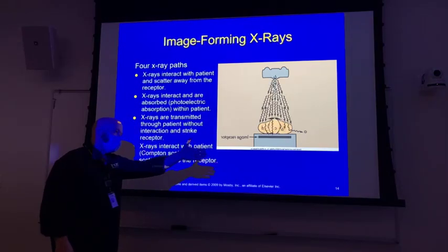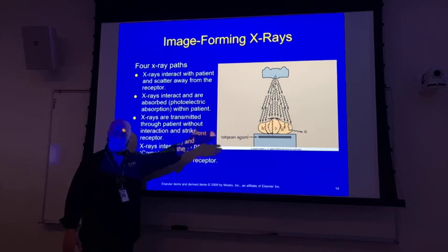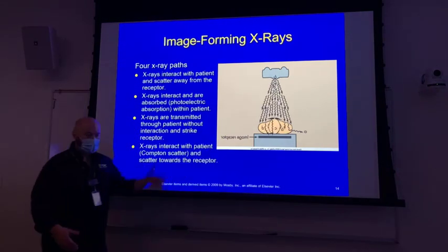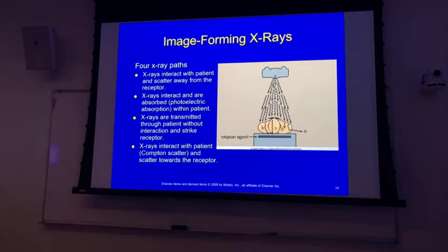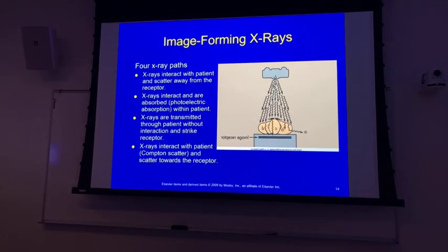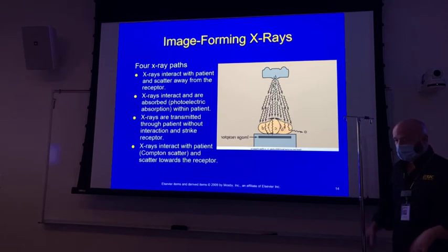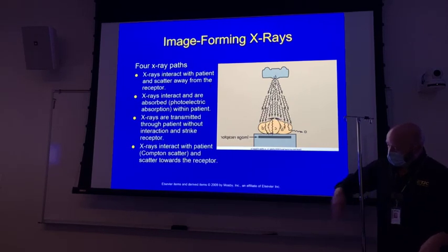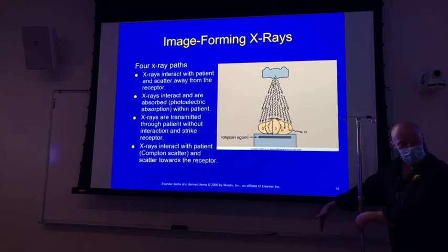Straight up this wall, on the inside of the x-ray room, what you had was a control panel. Okay, so we're shooting cross table laterals, and if the control panel were to be represented by this IV pole here, right? I'm standing here behind the control panel, and there's a partial wall that comes right here. Control panel is right over here, okay?